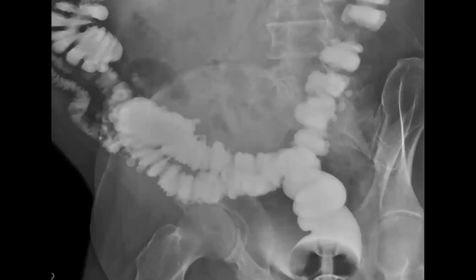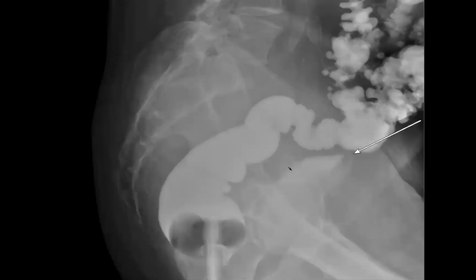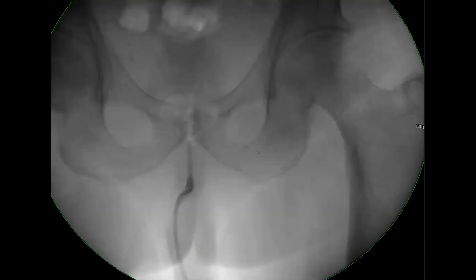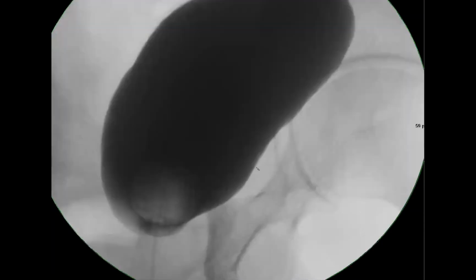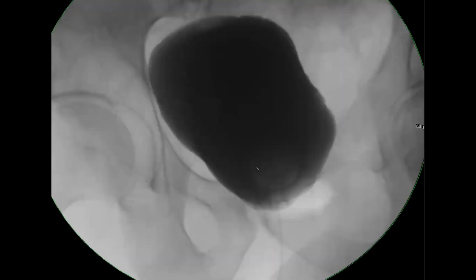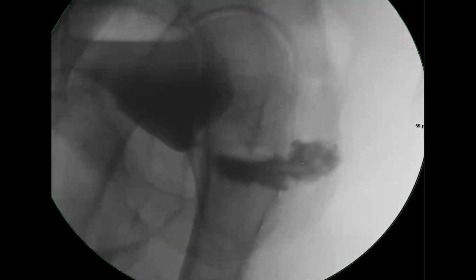Here we've got, most of the rectum looked very clean. We still have maybe gadolinium in the bladder. We weren't sure about a fistula. So finally, we did a VCUG. We put a Foley in, the bladder is getting distended, and then we removed the Foley and had them void. And finally, with that extra pressure of the voiding, we now see that tract between the cystourethral anastomosis going posteriorly and into the rectum.